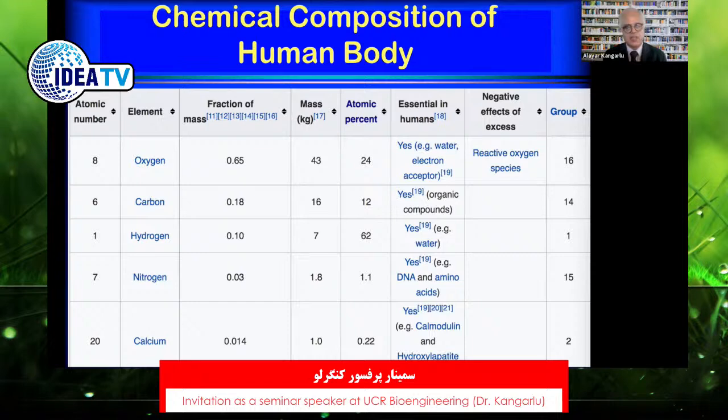And hydrogen has the largest gyromagnetic ratio, about 42.6 megahertz per Tesla, which basically means that if you throw a hydrogen atom in a magnetic field of 8 Tesla, the protons, which inherently have a spin quantum number and are spinning, with two quantum spin states, will line up. They will line their magnetic field up with the external magnetic field, and by doing that, they will precess around the axis of the magnetic field at that signature frequency of 42.6 megahertz per Tesla.